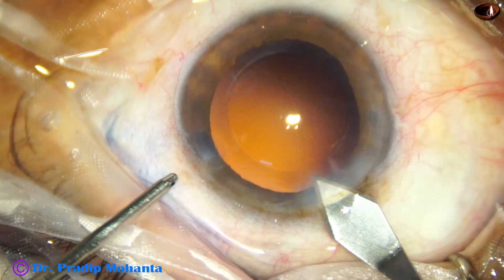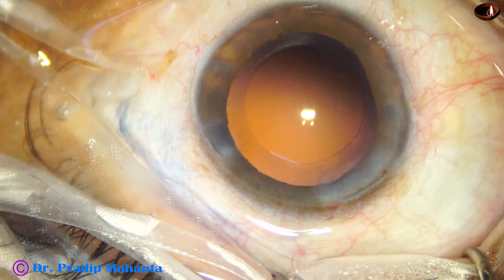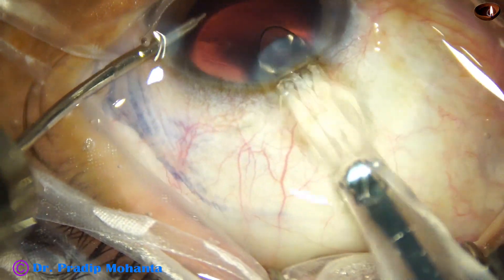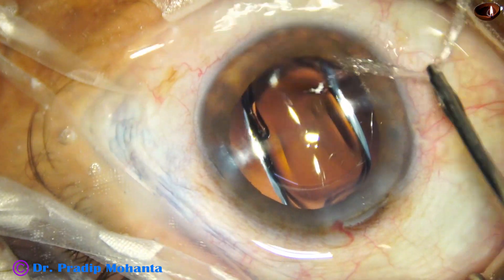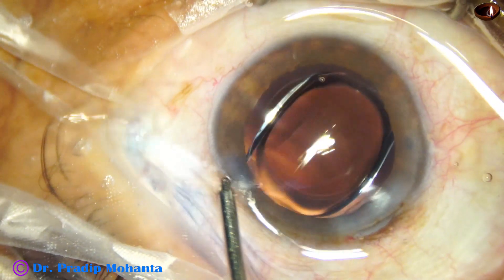The main wound is enlarged to about 3 mm because a B cartridge is being used. Here goes the intraocular lens — a hydrophobic, acrylic, single-piece, monofocal intraocular lens. The lens is dialed into position by the irrigating cannula itself.